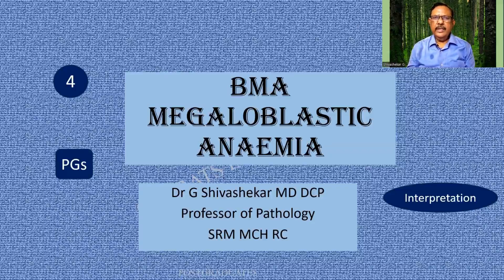Recently, after having started this bone marrow aspirations, one of the students had asked me the interpretation of it. So I thought it was apt to have one class started at least. And the topic for the day is megaloblastic anemia.